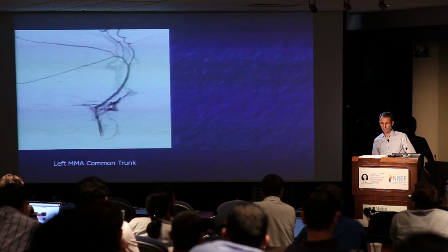One thing on this one picture, in my experience, you can't possibly tell exactly where the fistula comes in. It depends on where the other suppliers are coming in. But sometimes there's maybe a big common arterial trunk that leads to the fistula and gets many arterial supplies. So you have to look at multiple projections, multiple vessel runs, to figure out what is the last point where arteries enter and identify the fistula for the correct treatment. It can be very, very tricky. Yeah, I completely agree with that.